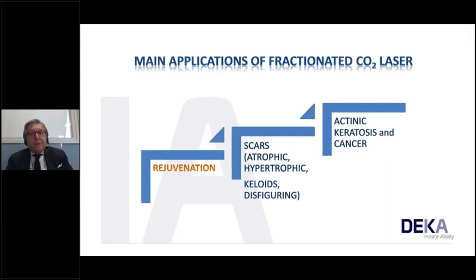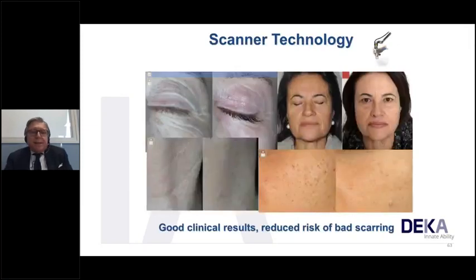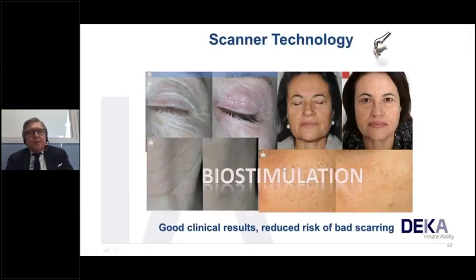And so the main applications of fractionated CO2 laser are rejuvenation, treatment of scars, atrophic, hypertrophic, keloids, and disfiguring scars, and actinic keratosis and cancer, non-melanoma cancer, of course. This is, at a glance, the good clinical results that we can have with this clinical indication. Why? Because we biostimulate the skin with the fractional.